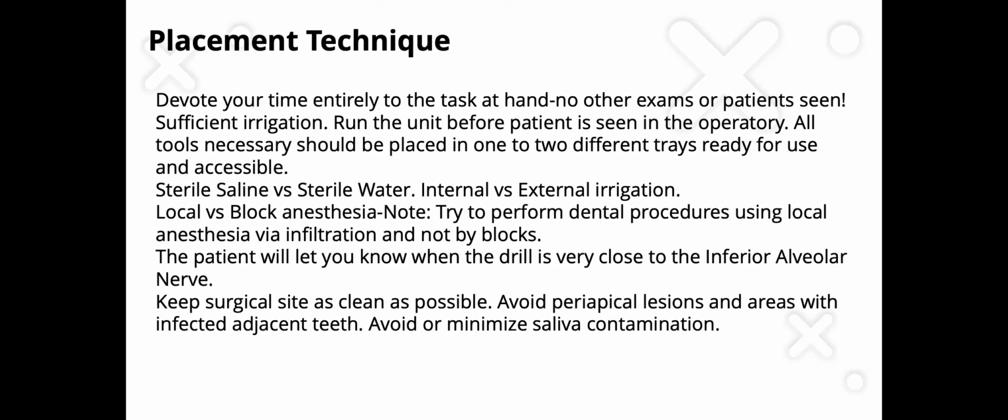The reason is the patient will let you know when the drill is close to the nerve. There's no real concern for any kind of feeling on the patient's part, because in the bone there are no nerves for the patient to feel any drilling.